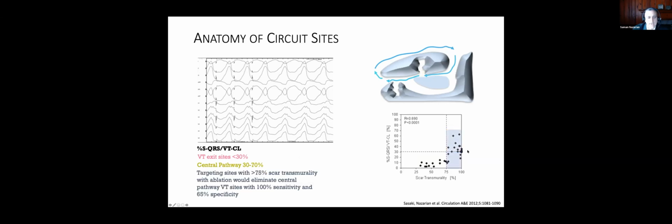Focusing, I think, on these regions with higher transmurality is extremely important, particularly when we are going after a substrate modification approach. Now, here's an example of one of these 2D images without perfect resolution, where I've segmented the ICD lead. I used to use this for registration. I don't do that anymore. The healthy myocardium is here in the blue. You can see it's not great resolution, and the transmural scar is in gray.